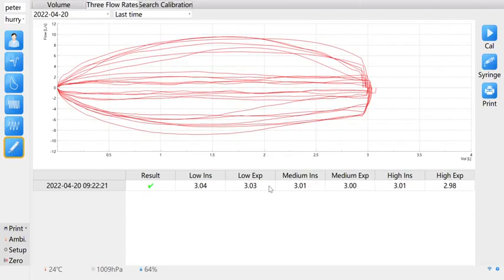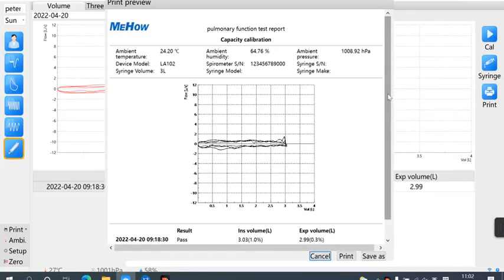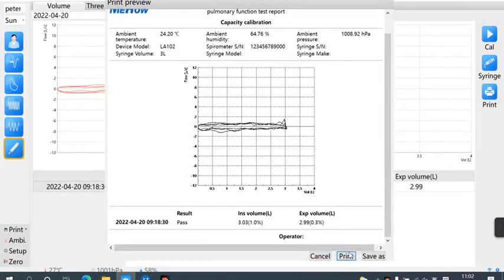A green tick indicates that the calibration is passed, and a red cross indicates that the calibration is failed and needs to be recalibrated. The judgment standard is whether the low, medium and high values of inspiratory and expiratory are within plus or minus 2.5% of 3. Click Print on the right to view the calibration report.